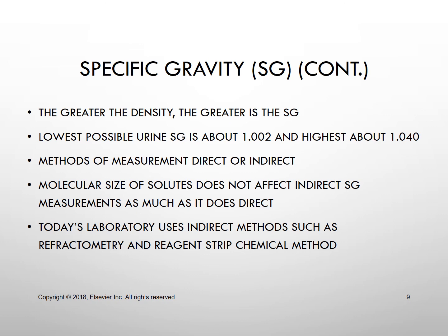So we're going to talk about the ways that specific gravity is measured in today's lab, by either the refractometer or the reagent strip.